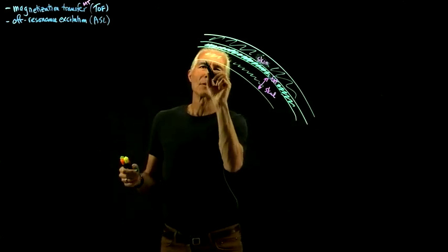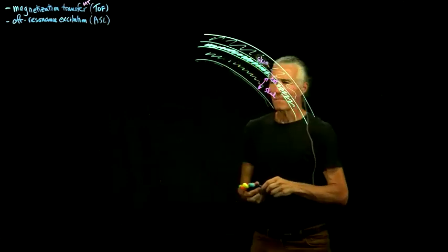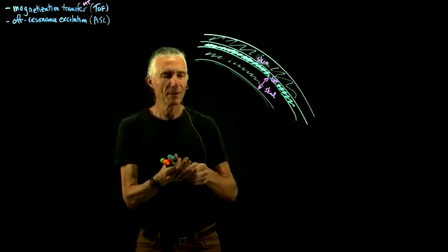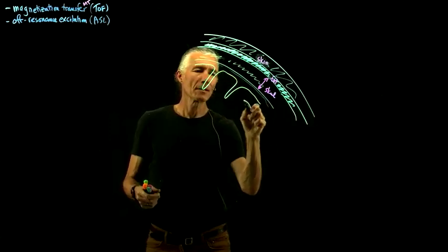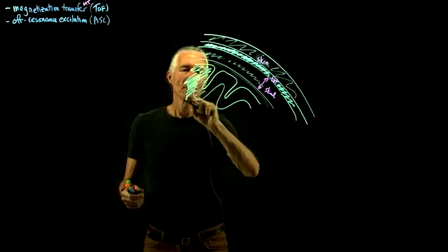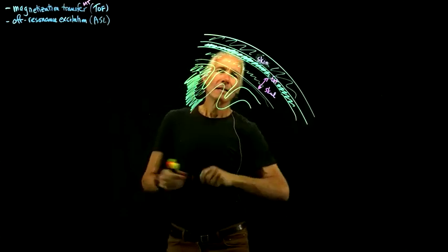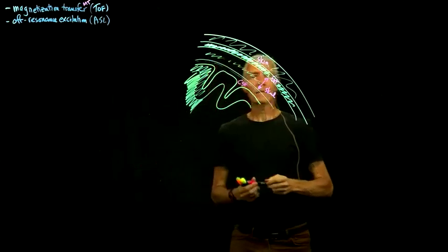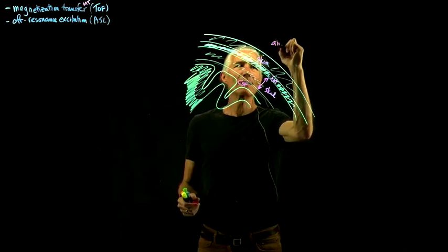Sometimes you can see the little dura. The dura is like a leathery layer that kind of protects the brain. And then further inside, you've got the actual brain, which is bright again. So here's the gray and the white matter, and the white matter's really bright. And then what's in between here? You got the CSF. It's dark, cerebrospinal fluid. And then you got air out here. So the air is dark.